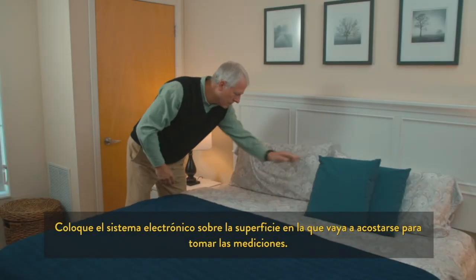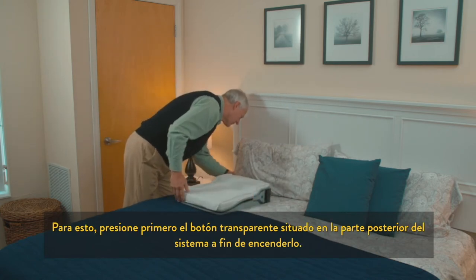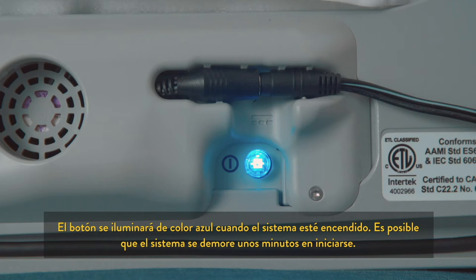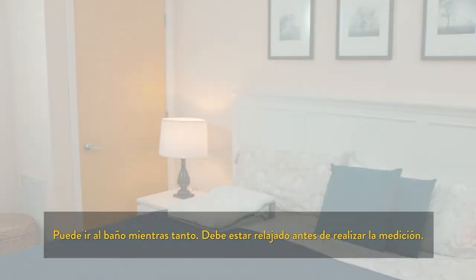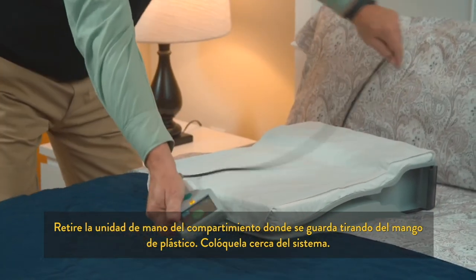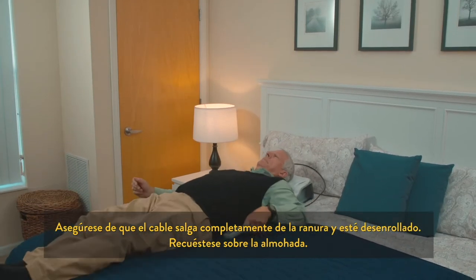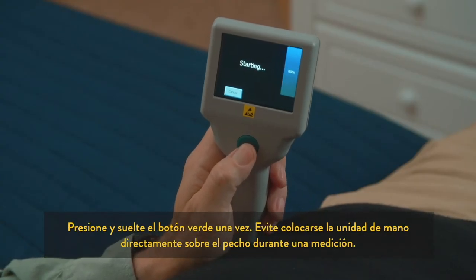Place the electronics system onto the surface where you will lie down to take your readings. To take a reading, begin by pressing the clear button on the back of your system to turn it on. The button will light up blue when the system is on. The system may take a few minutes to start. During this time, feel free to use the bathroom. You should be relaxed before taking your measurement. Remove the handheld unit from the storage cradle by the plastic handle and place it near the system. Make sure to completely unwind the cable from its groove. Lie down on the pillow. A large green circle that reads "Start" will appear on the screen of the handheld unit. Press and release the green button once.